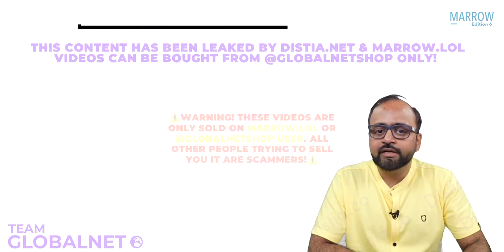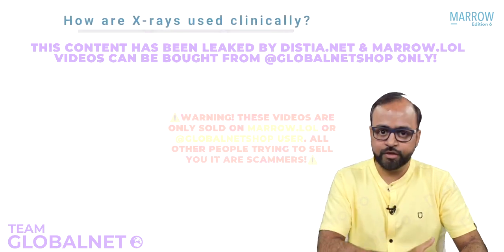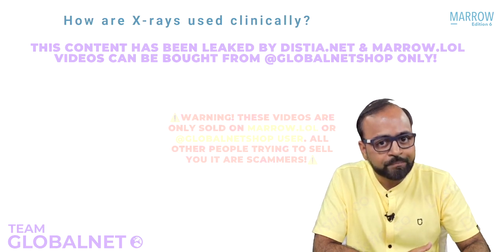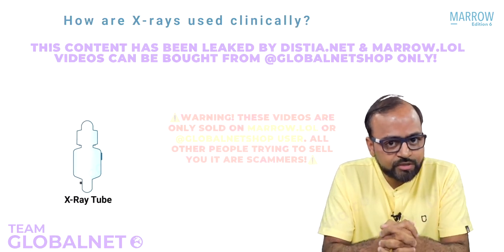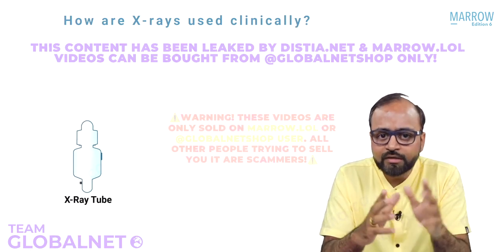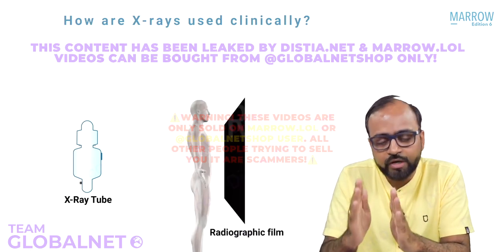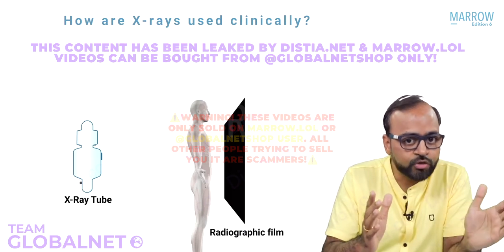Now friends, let us have some fun with this X-ray beam which is coming out from the X-ray tube. Now tell me, how is this X-ray beam used clinically? When you go to an X-ray room and see how an X-ray is being done, you would realize that the patient is positioned in such a way that an X-ray film or an X-ray cassette lies on one side of the patient and the X-ray tube is on the other side.